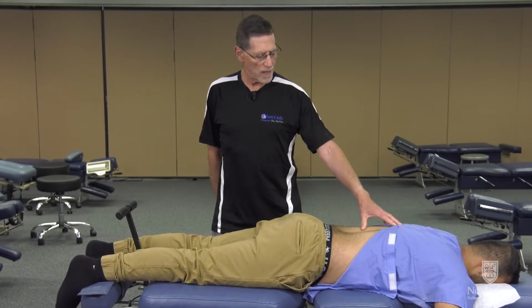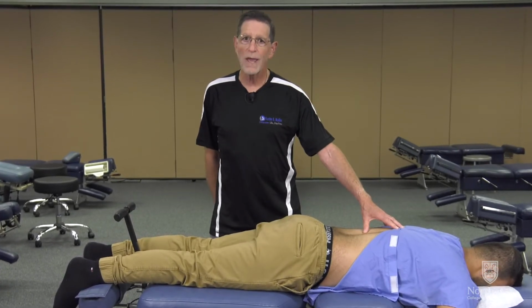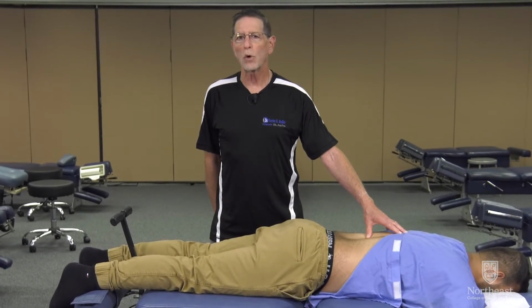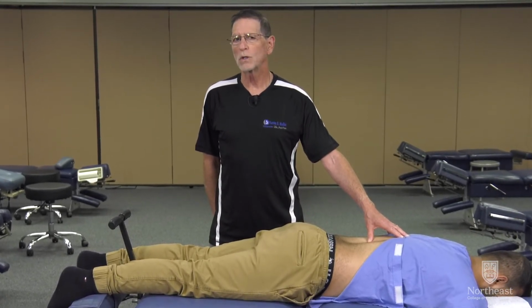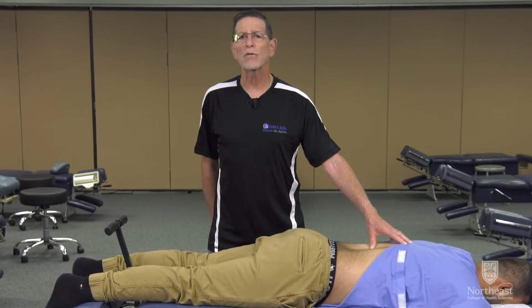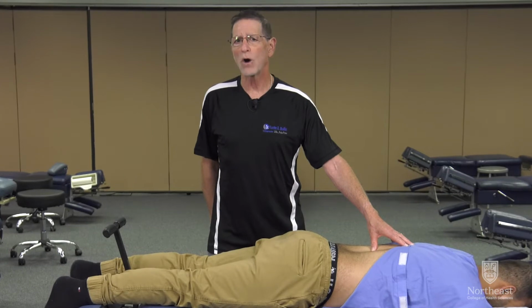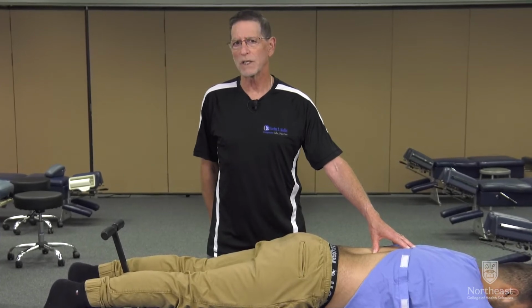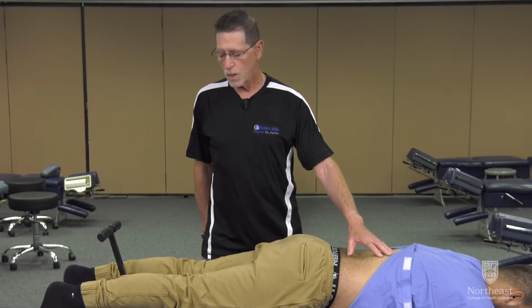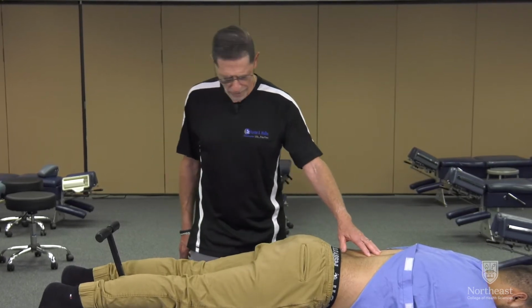So here we have a model patient on the table, and I'm going to demonstrate the application of what is called Protocol 1, which would be utilized to treat a patient with an acute sciatic radiculopathy that is being caused by a lower lumbar disc issue. So our patient is already in the prone position where we start them out.